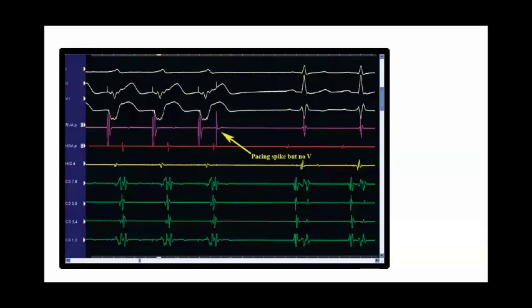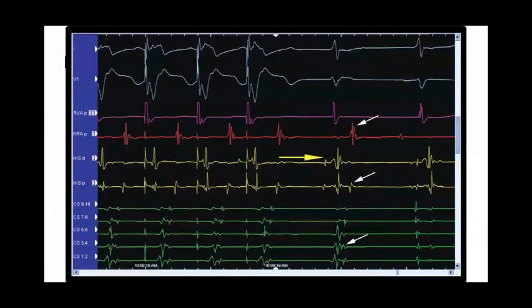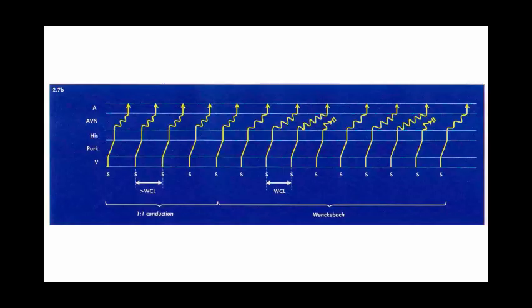So this was mostly the ventricular extra stimulus testing. Then I can do the ventricular straight pacing with gradually increasing the rate, and it will give me similar information, like whether there is conduction or not, and where the first A is conducting. We call this concentric atrial activation, and it will decrease with increasing rate. The VA time will prolong, and this is called decremental conduction, making me more sure that the conduction is occurring via the normal conduction system.